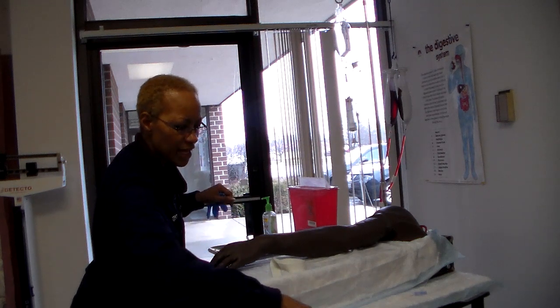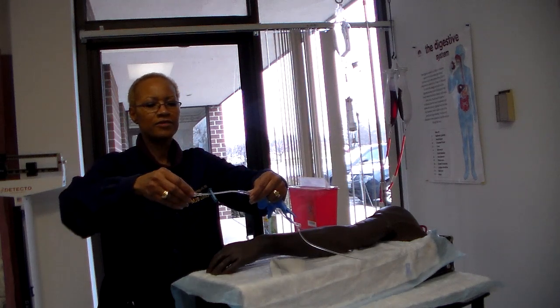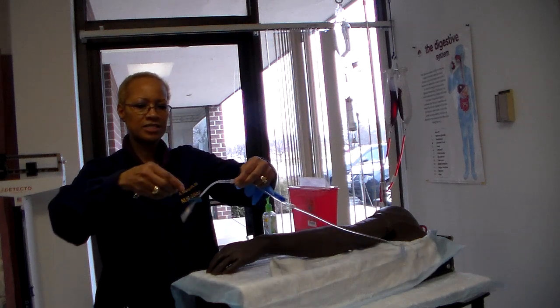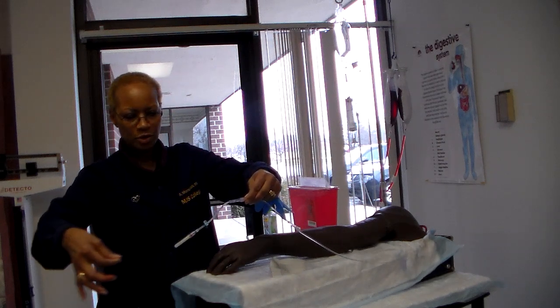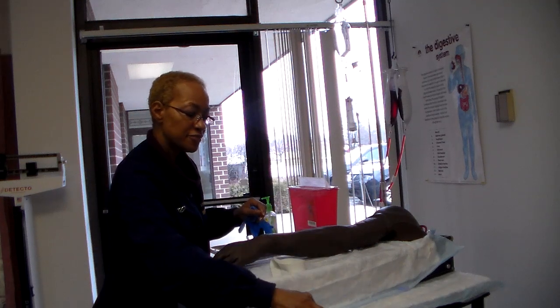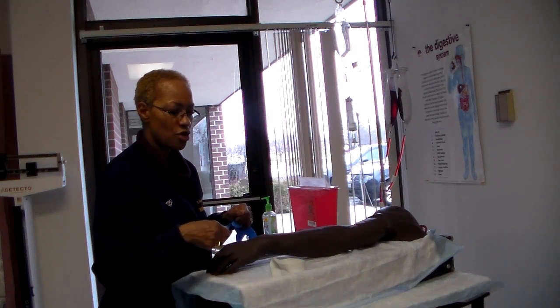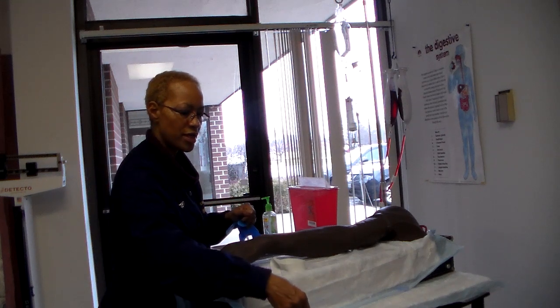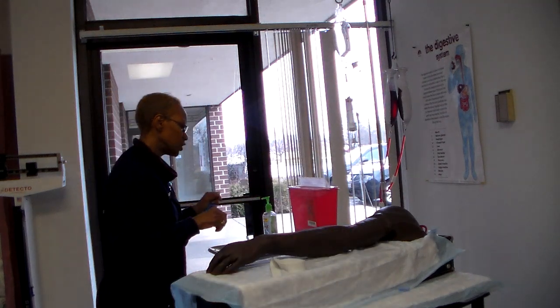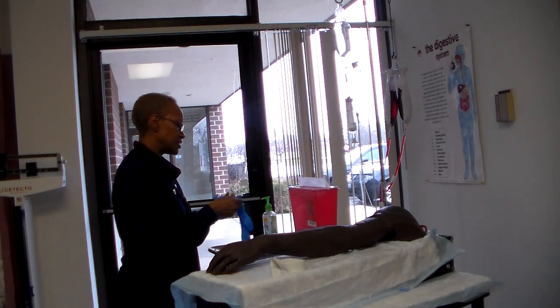Okay, and this one already has an extension set on it. Anytime you can, try to have an extension set on your tubing. So we added on this extension set, and of course purged all the way through this. The reason for that is because as you are changing your IV site, you don't want the weight of the tubing right at the site. Okay. Then now we're back on step 16.